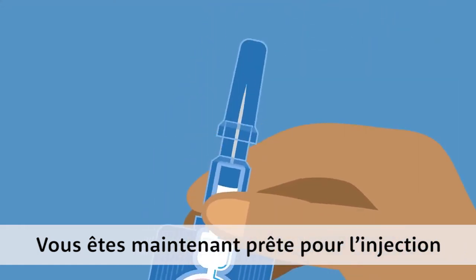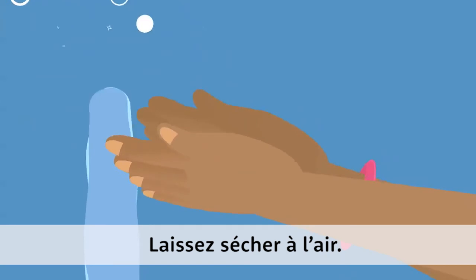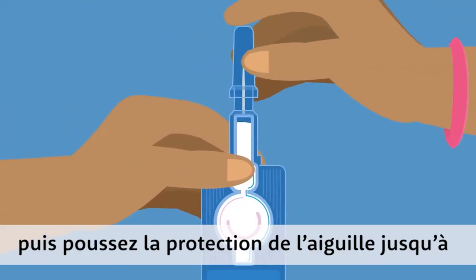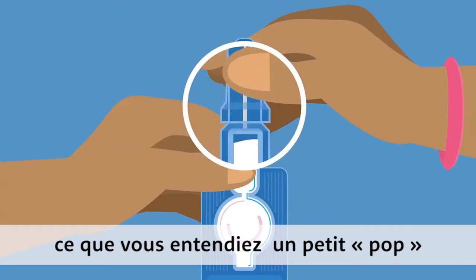Now you're ready for the injection. Wash your hands and the injection site and let them air dry. Hold the port up with one hand, then push the needle shield into the port until you hear a popping noise, like a pen click.